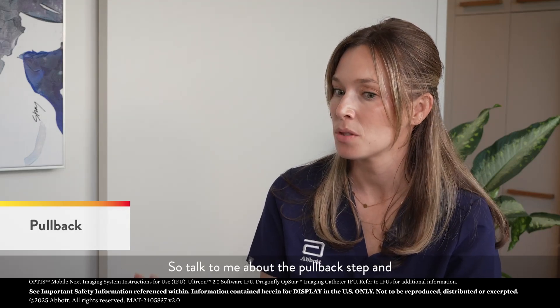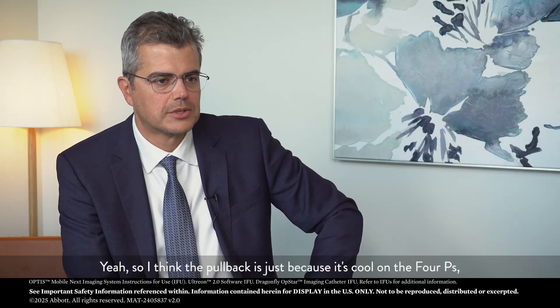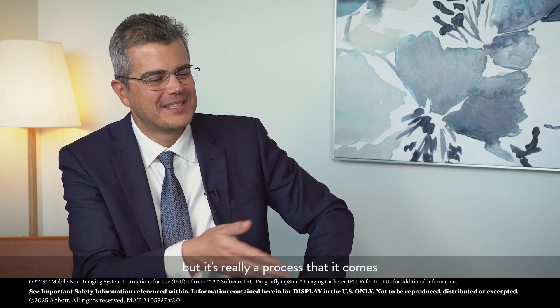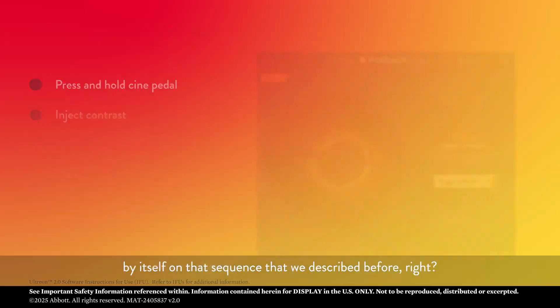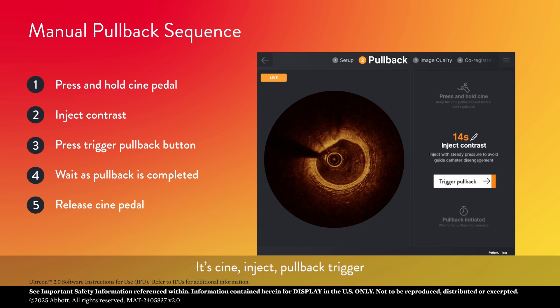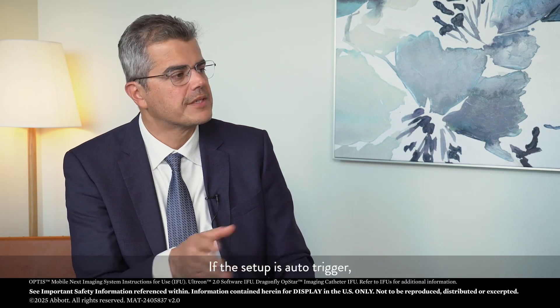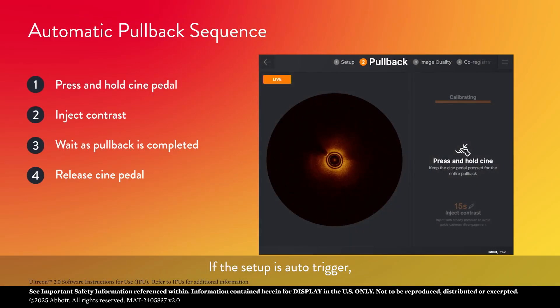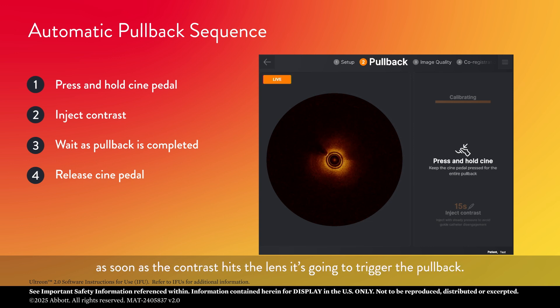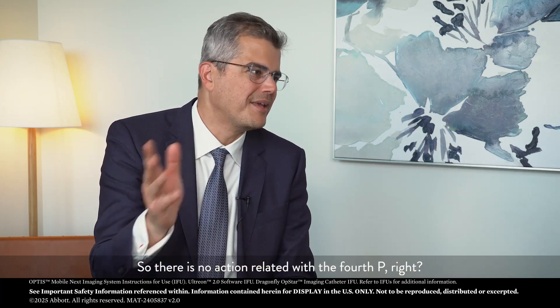And that brings us to pullback. The pullback is really a process that comes by itself in the sequence we described: cine, inject, pullback — or trigger, whatever command you use for manual or trigger. If the setup is auto trigger, the only thing you need to do is ask for cine, inject, and as soon as the contrast hits the lens, it's going to trigger the pullback automatically. So there is no additional action related with the fourth P.